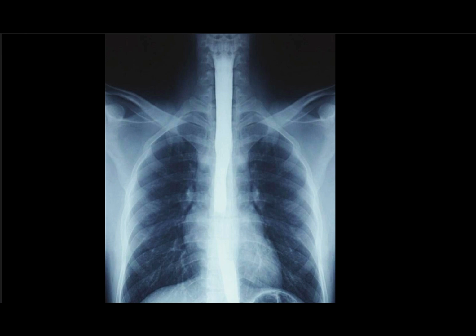Now, remember, the barium, which is the contrast media, is radio opaque. Radio opaque, meaning it absorbs X-ray very well, and that's why it appears whitish. So the patient takes it in, it coats the lining of the esophagus so that it becomes very prominent and whitish when you shoot rays at it.